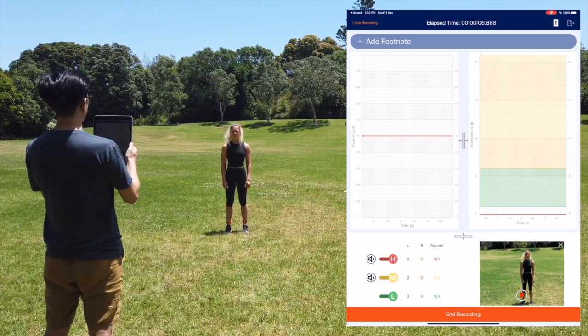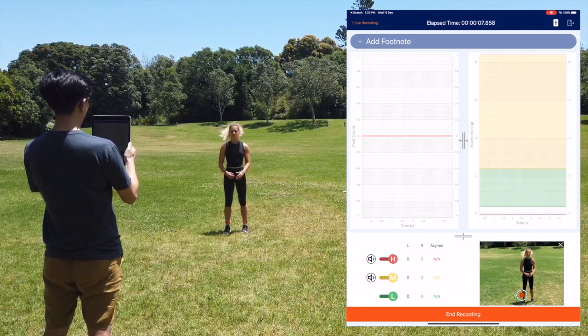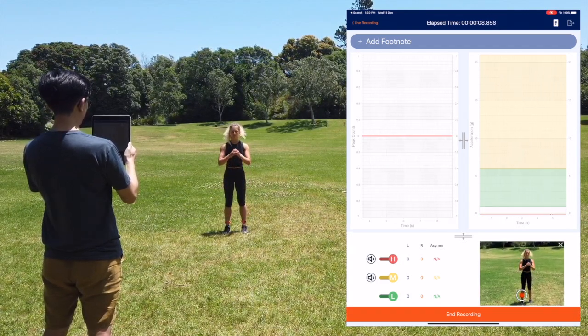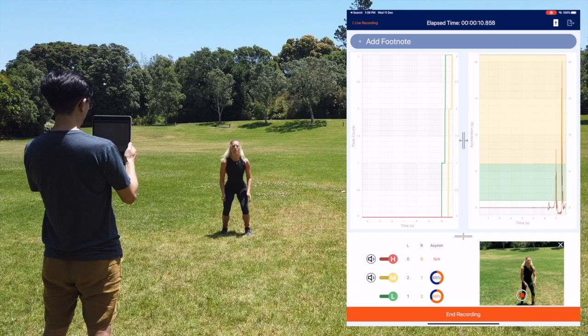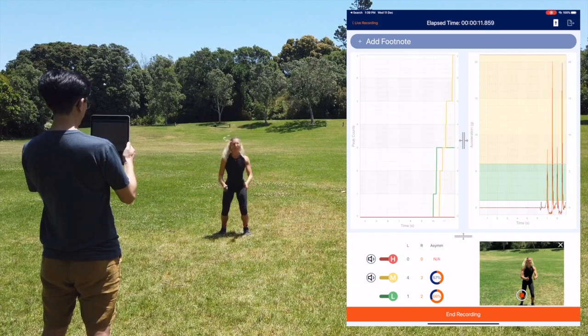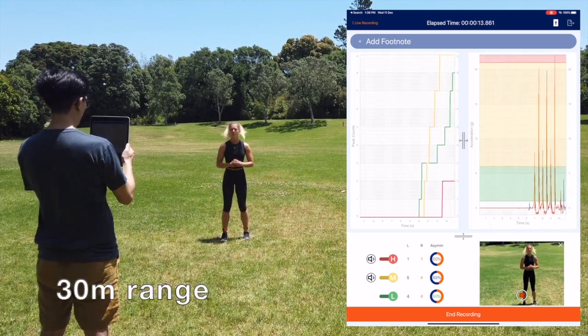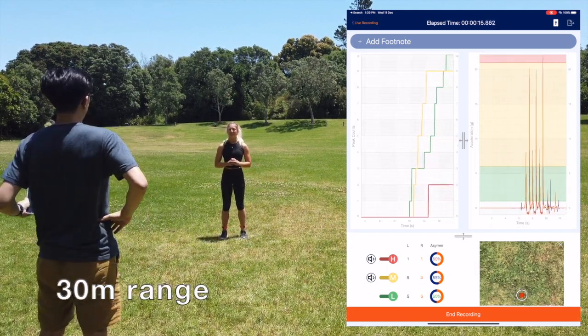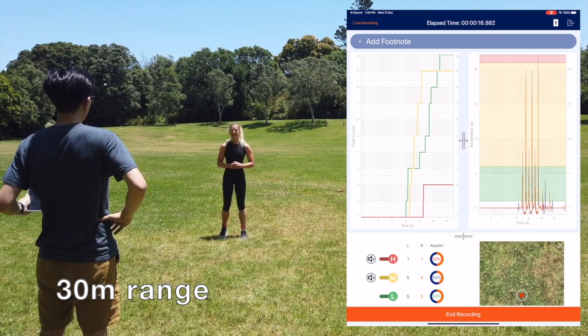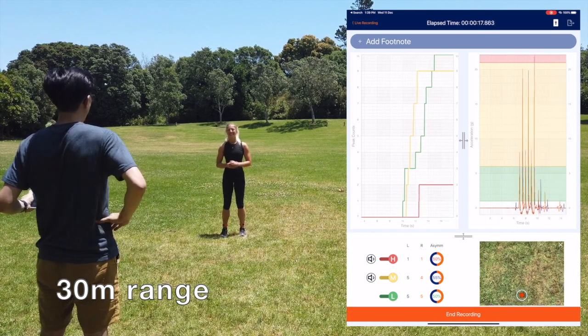On the right hand side of the screen, you can see live resultant acceleration data being streamed from the sensors to the iPad. To maintain a live recording connection, it's important to remain within 30m line of sight of the sensors.